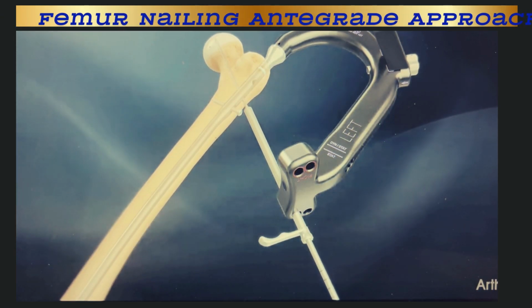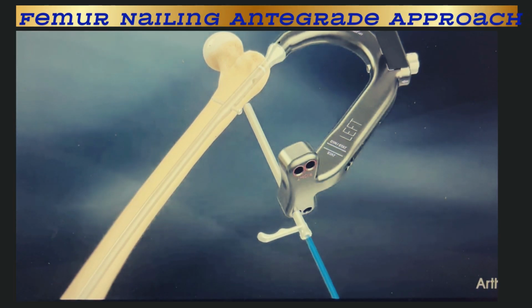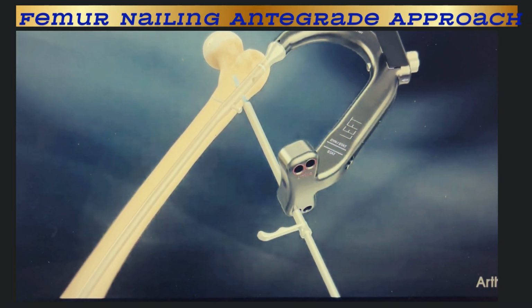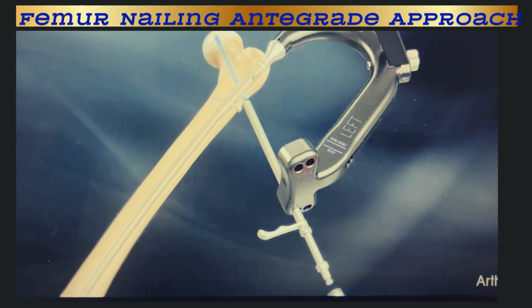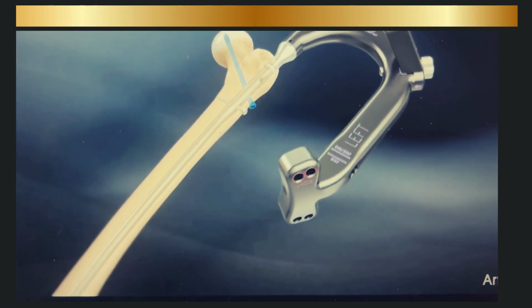Remove the 3.2 mm guide pin out of the screw sheath and advance the selected screw into the femoral head using the T-handle and 5 mm capturing hex driver. Insert the screw until the black laser edge line is at the level of the screw sheath.